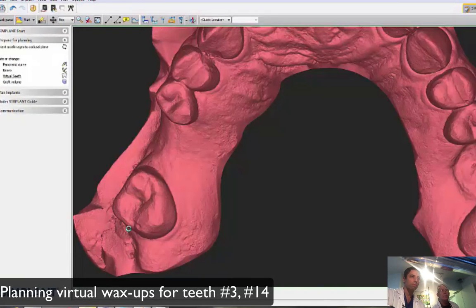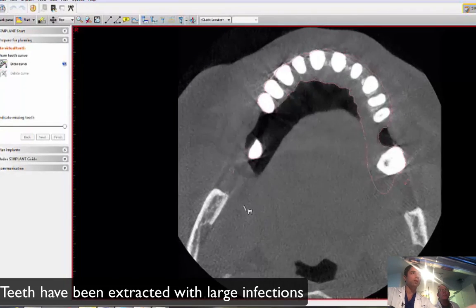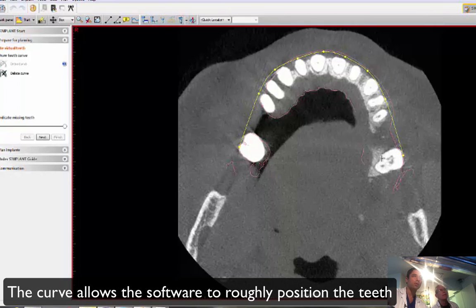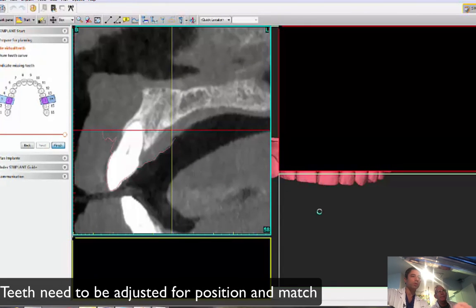To place virtual teeth, remember what we do: we map the contours of the teeth and draw a curve on the buccal — roughly, it doesn't have to be very accurate. Now you tell the software we're missing teeth 3 and 14. Select 3, 14, finish, and now we just put them in position.